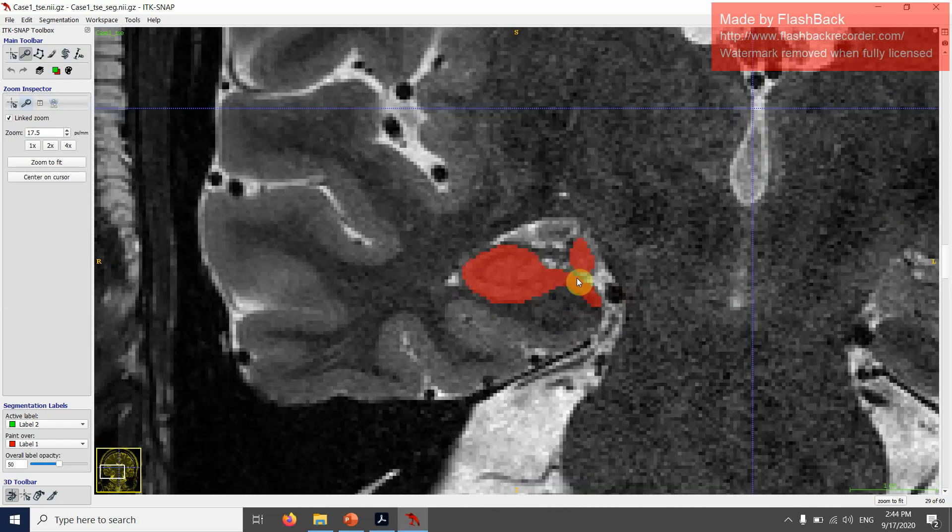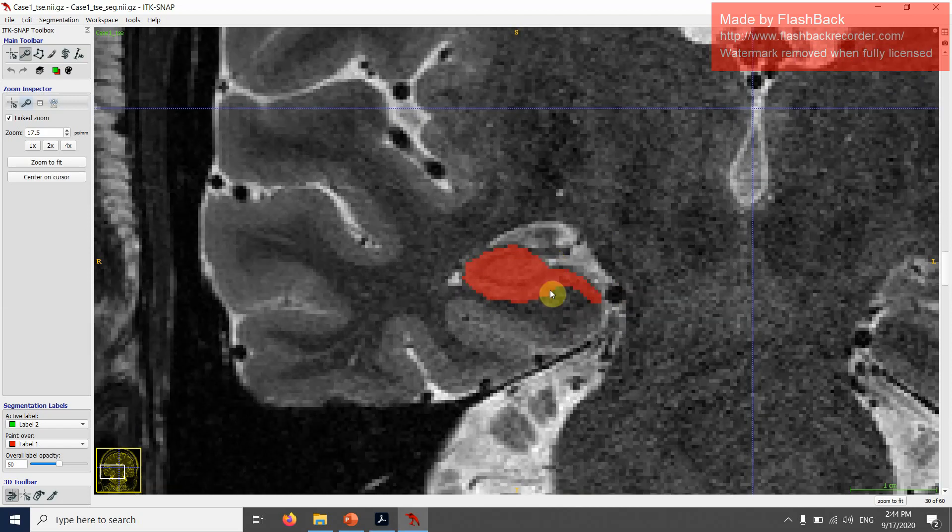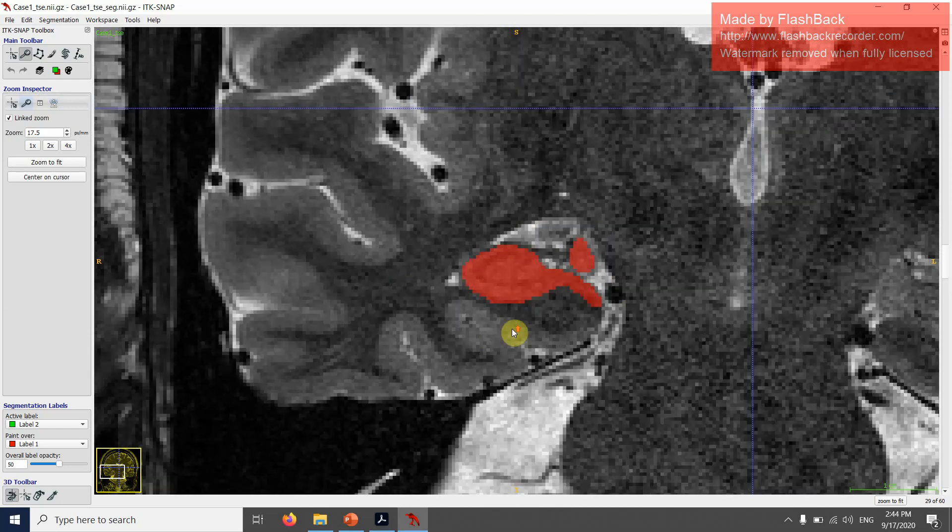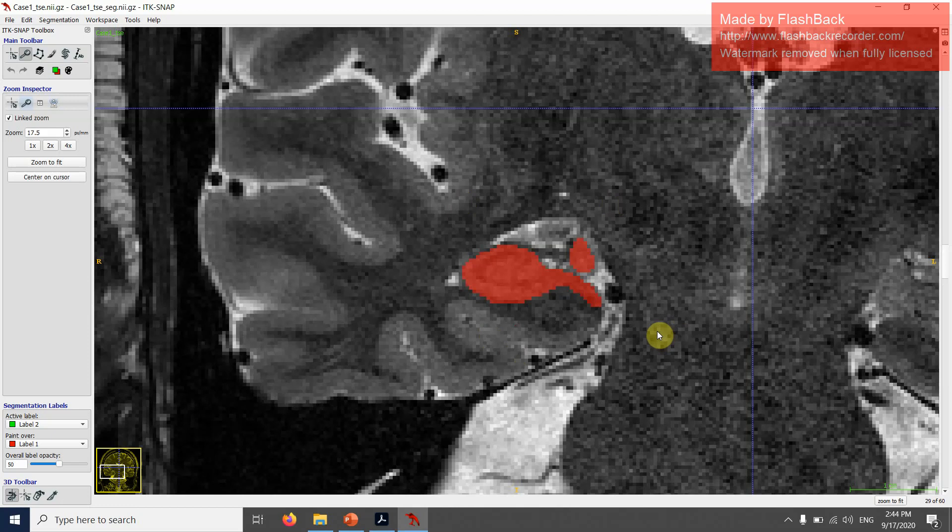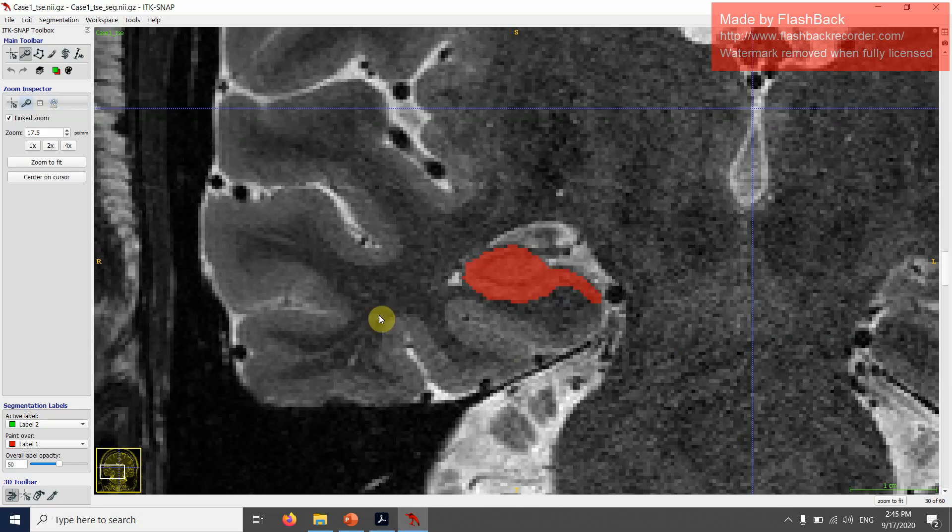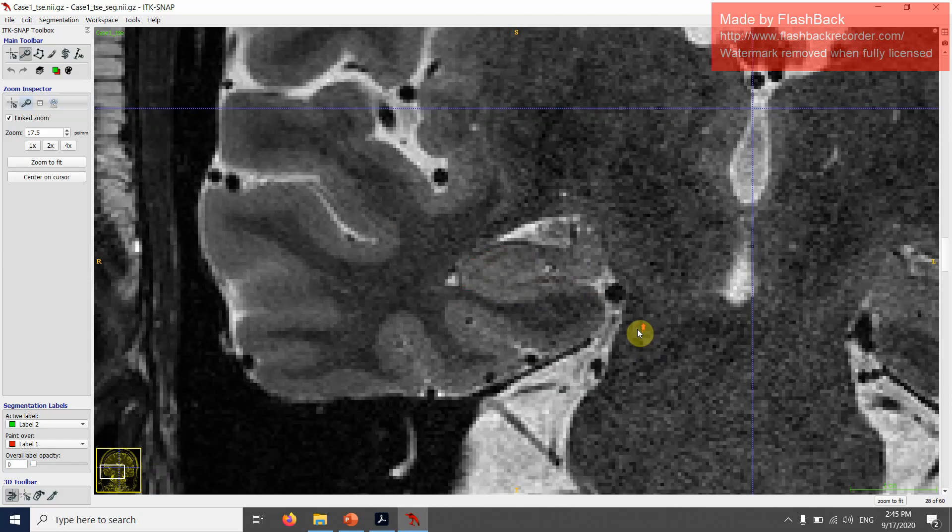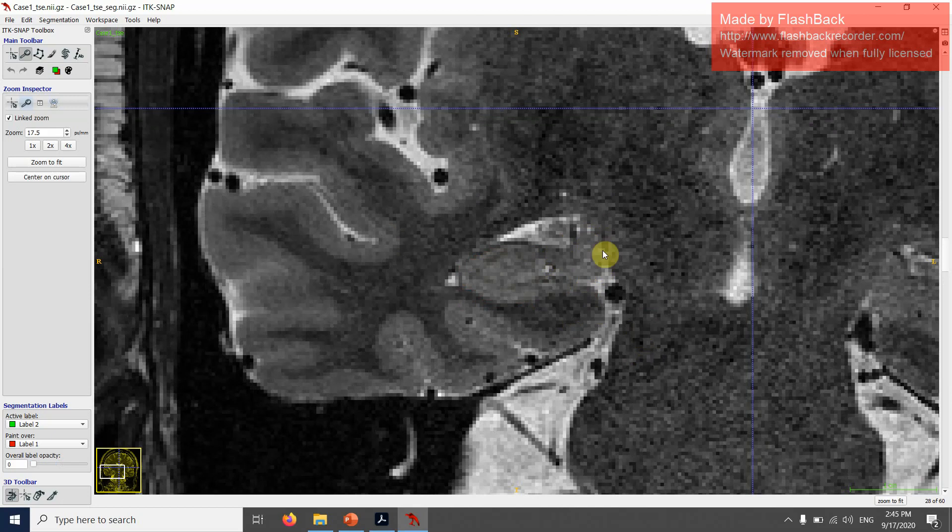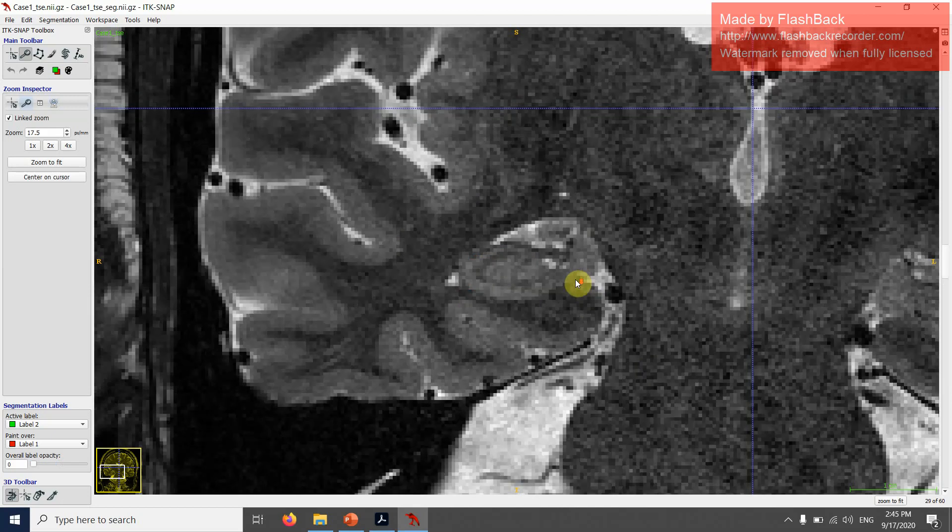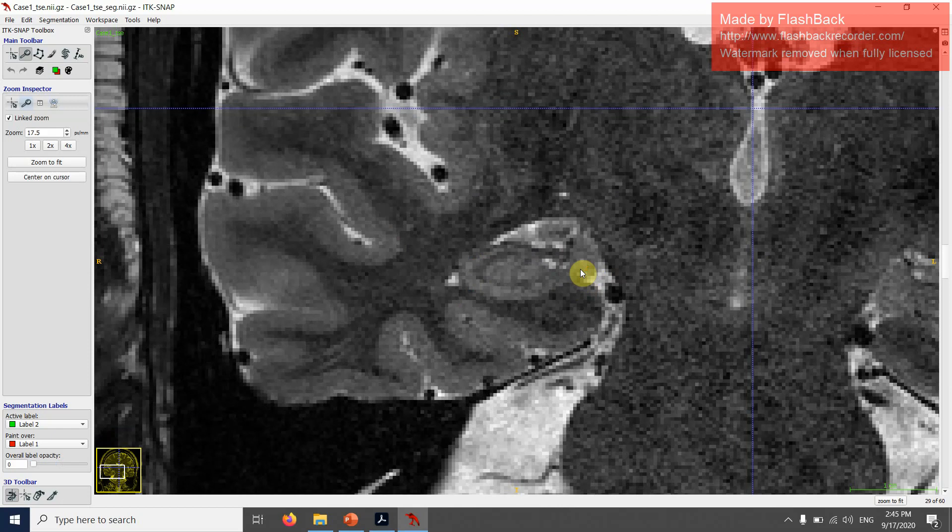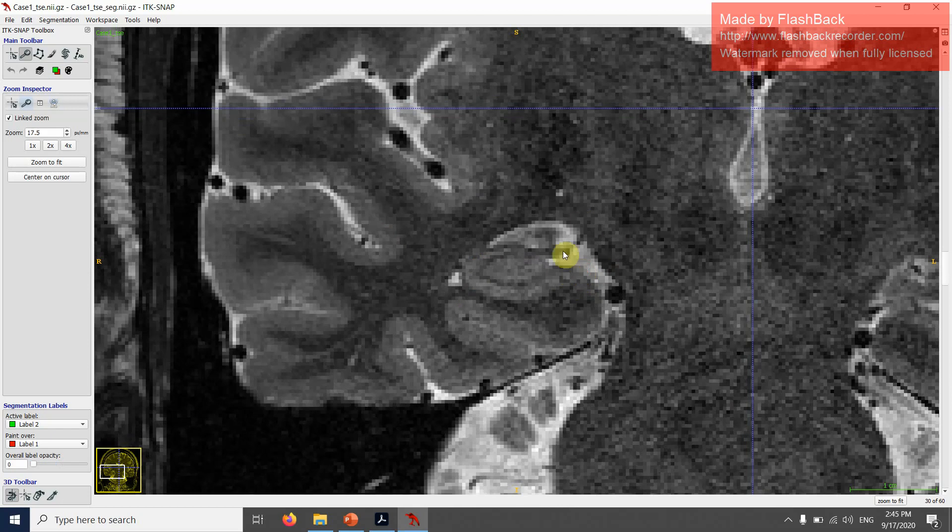This would be the slice in which the uncus has disappeared. I think I would call this the most anterior, most posterior slice of the anterior hippocampus, and this would be the first slice of the posterior hippocampus. To just show you this without the segmentation: this is still gray matter, this is gray matter, and then here you can see it disappear. It's very bright.